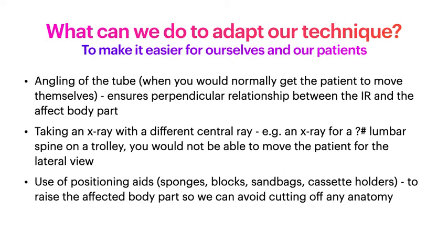So for example, if you're doing a lumbar spine x-ray, typically if you've got a GP patient, for the lateral view you would ask them to roll over onto either their left or their right side, and then you would keep the vertical central ray centered over the table bucky.